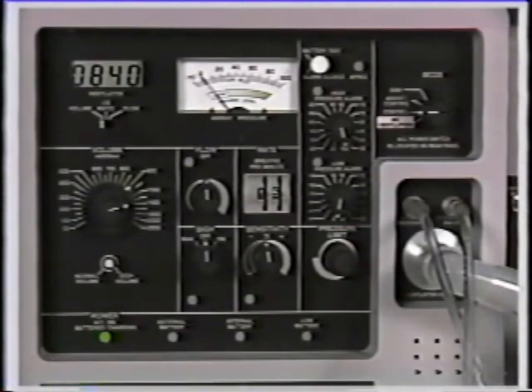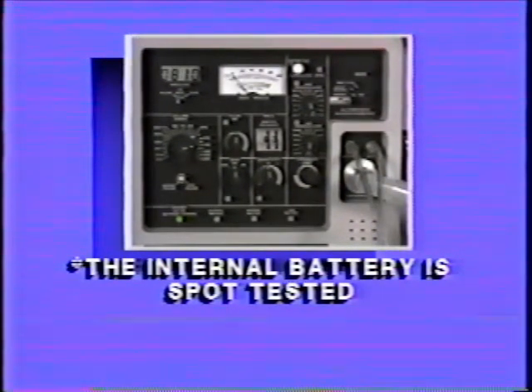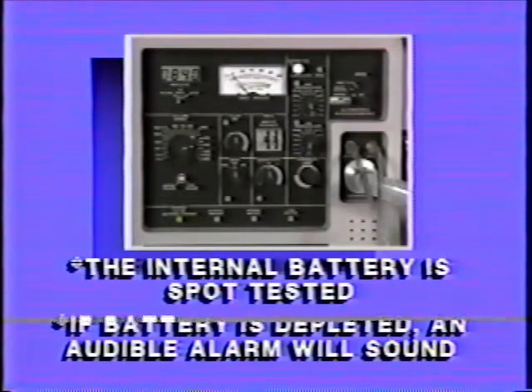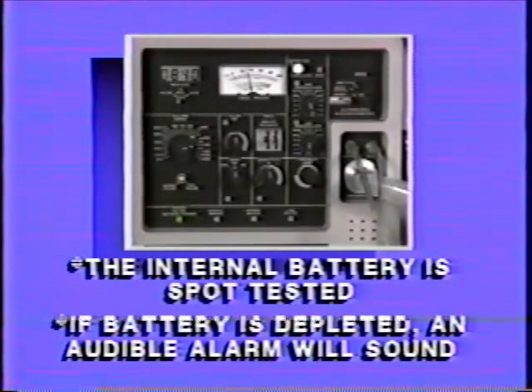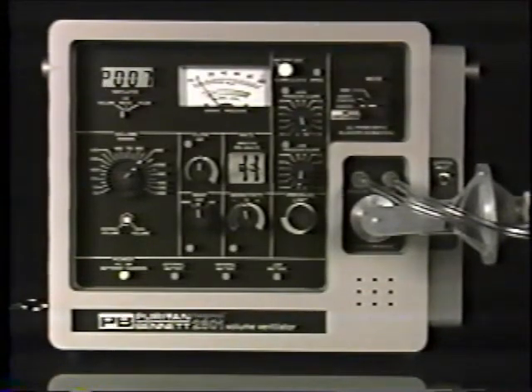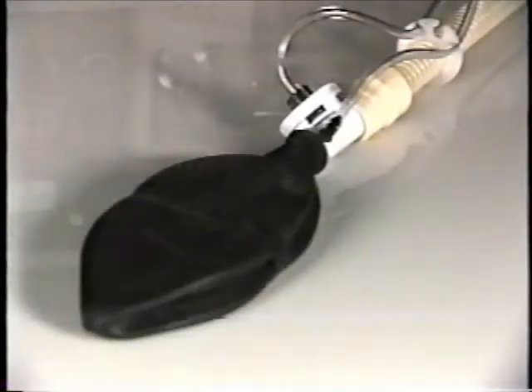When being powered by AC or external battery, the internal battery is automatically spot tested every 15 minutes for low voltage. If the internal battery is depleted or fails, there will be a continuous audible alarm, but the ventilator will still operate on AC power or external battery. It's important to remember to set and confirm all control settings prior to connecting the patient to the ventilator. Puritan-Bennett recommends using a rubber test lung for this purpose.